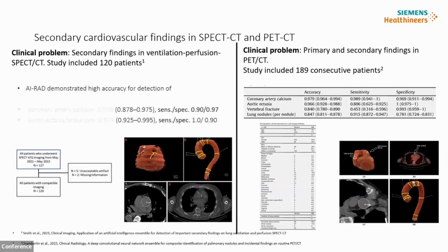Finally, there are also many more opportunities for concurrent evaluation of coronary artery calcium, for example in SPECT or PET examinations.